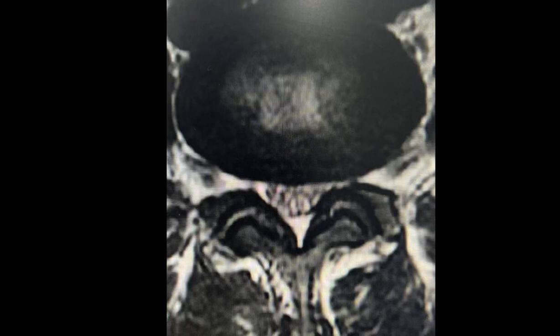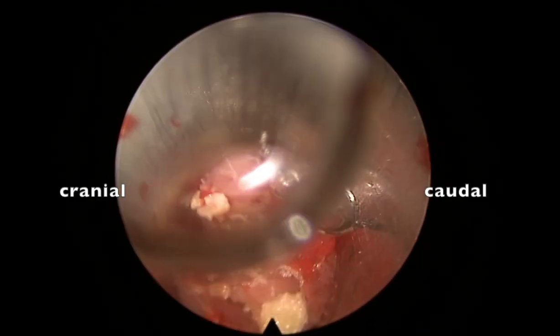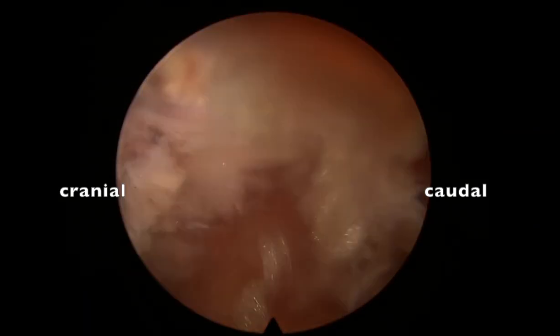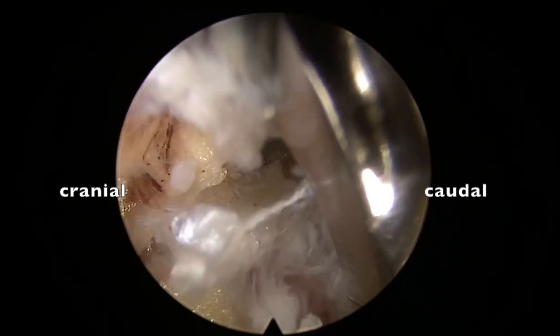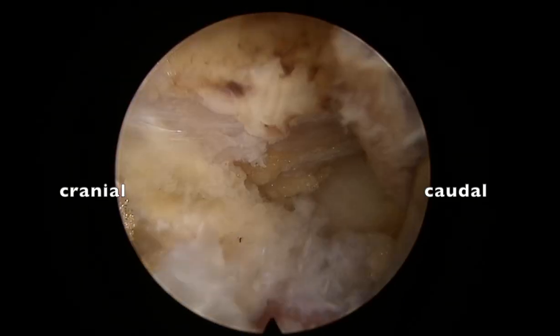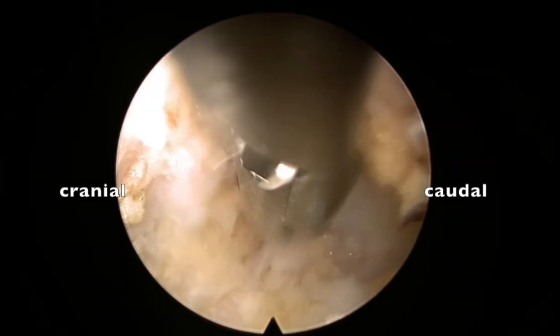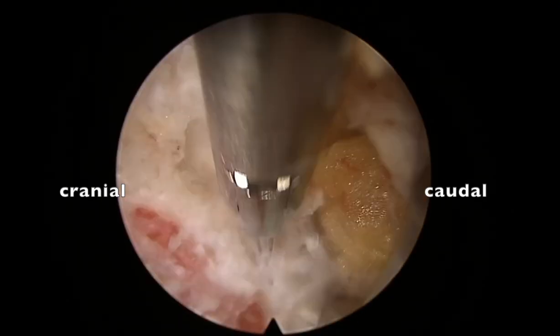45-year-old female with severe left radiculopathy, having left lateral recess stenosis, with interlaminar approach. Once you put a scope inside, this is what it looks like. Muscle fragments are there and removed. Nine o'clock being cranial, three o'clock being caudal. You can see at six o'clock the bony structure — that's the facet and the facet-laminar junction of L4.